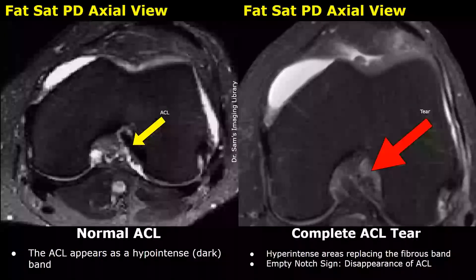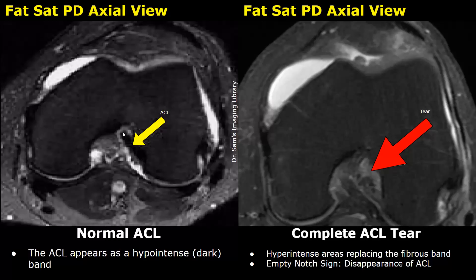These are axial images of the knee. In the image on the left, we can see the normal ACL — this hypointense fibrous band is the ACL. In the image on the right, we have a complete ACL tear. We find hyperintense areas instead of the fibrous ACL band. This type of appearance — the empty notch sign — can also be seen in axial views.